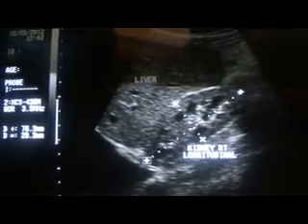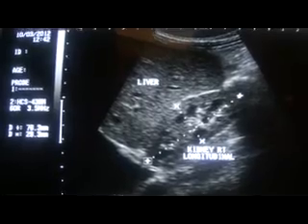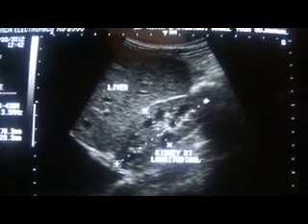Secondly, these cystic areas are representative of pyramids in the medullary region, so this is the medulla of the kidney. The pyramids are quite prominent, significantly prominent.